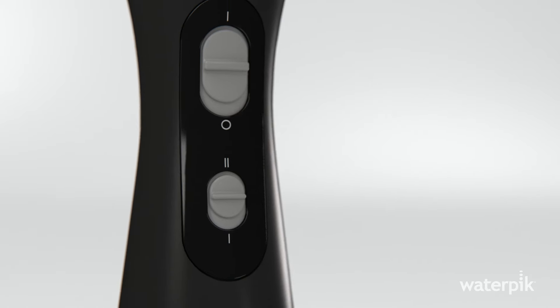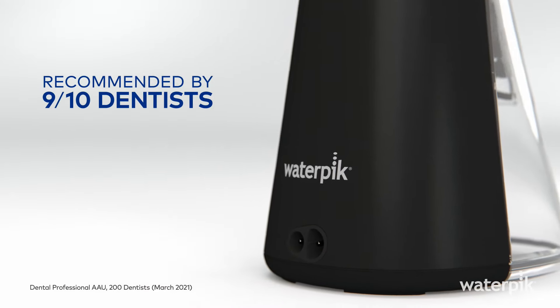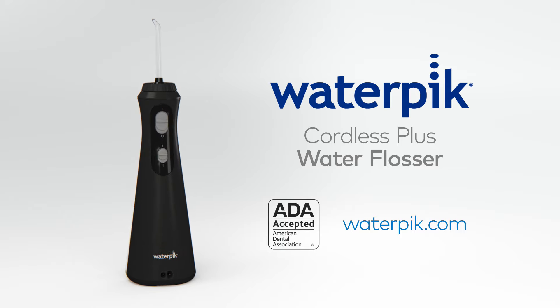Have you seen a cleaner gum line? Yeah, I think not. Over 225,000 five-star ratings and the number one brand recommended by 9 in 10 dentists. Go online or ask your dental professional about Waterpik Cordless Plus.